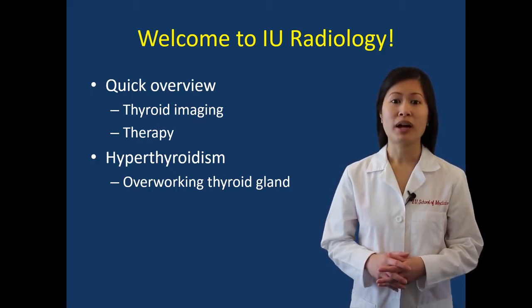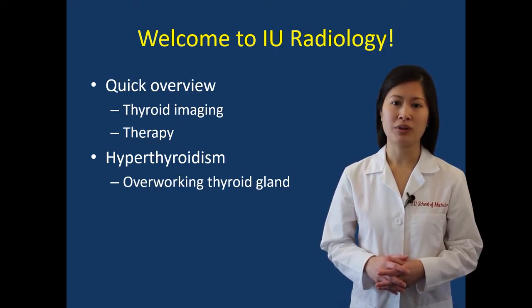In addition, you are watching this video because your physician has ordered a radioactive treatment for your hyperthyroidism. We cannot be sure if you will actually be treated until we've completed your scan, but please listen to the following information so we can answer any questions you may have.